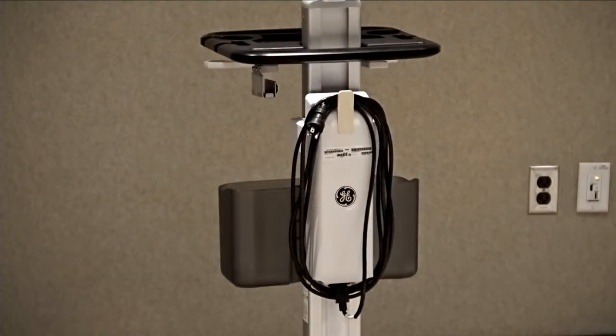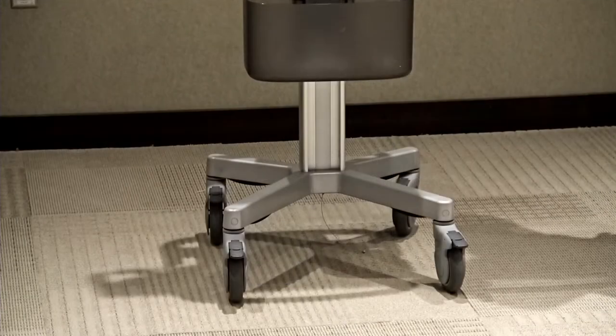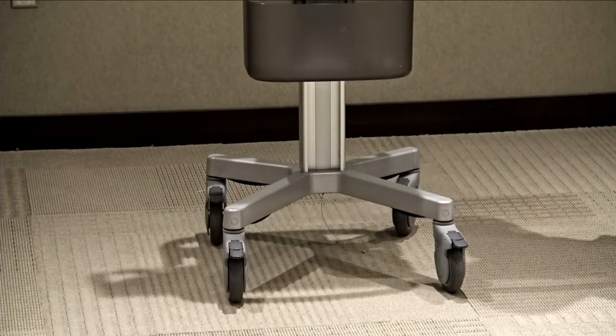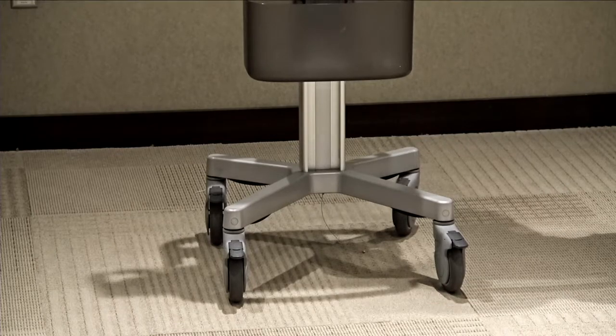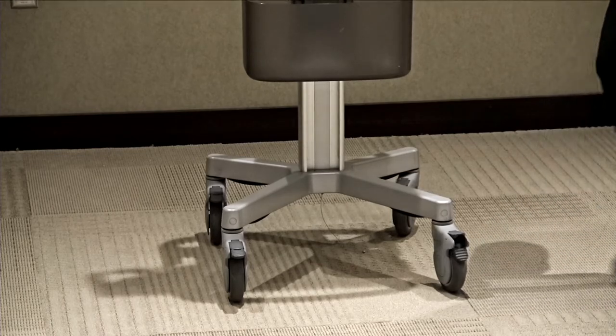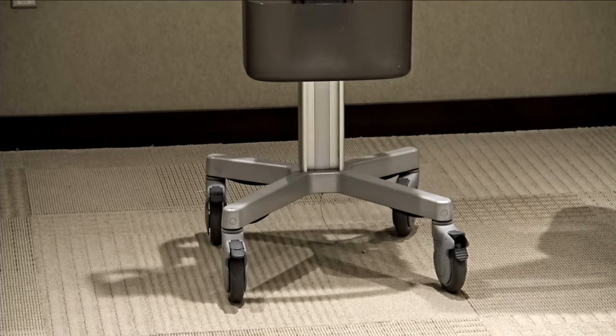The Venue Go comes with a power cord management solution for easy storage. The Venue Go cart has a brake on each wheel. To activate the brake, press down on the front gray lever. To release, press the top gray lever.